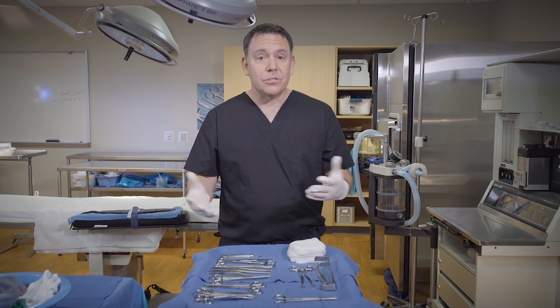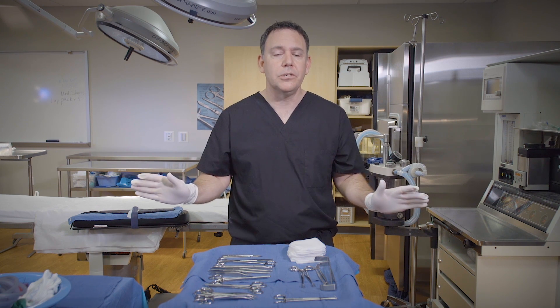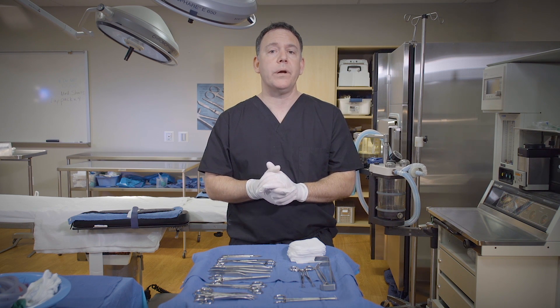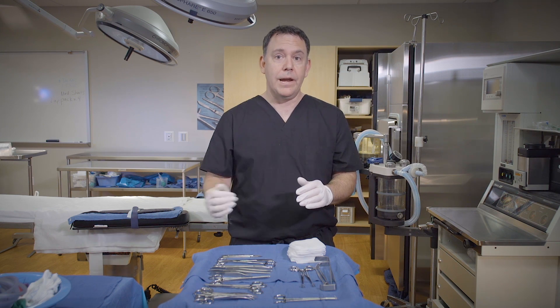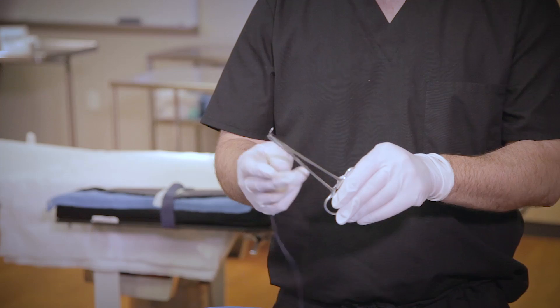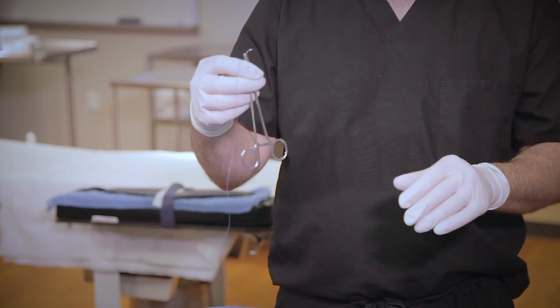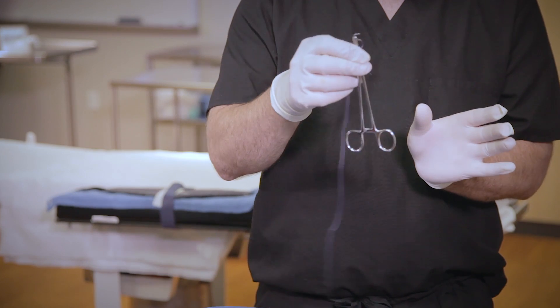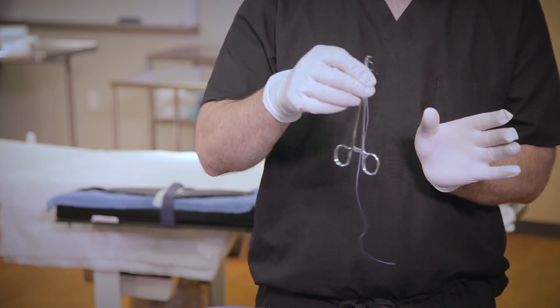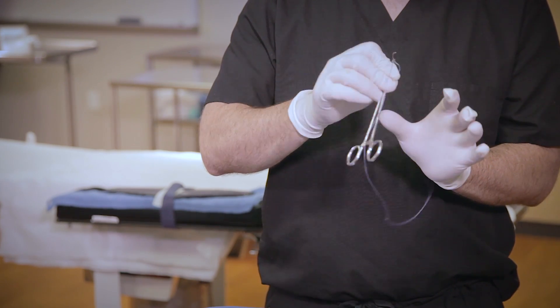The last instrument I want to pass is the needle holder. It is very similar to most of the basic instruments, except that we have a needle direction to think about. I tell my students to make sure that the needle tip is pointing toward the midline and at the surgeon's heart. My finger is still at the box lock — I'm going to point it toward the surgeon, nice and firm — and they still have that grasp reflex.